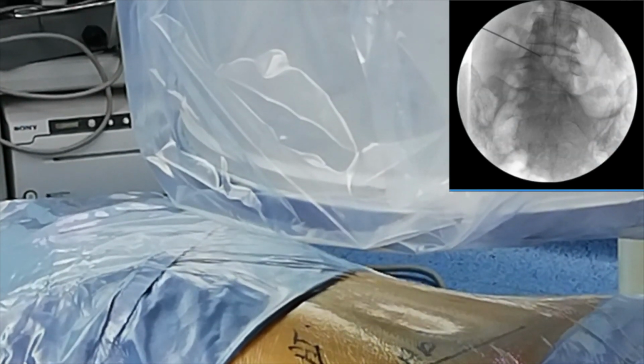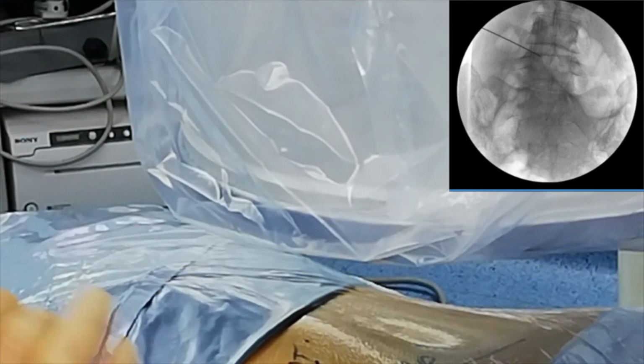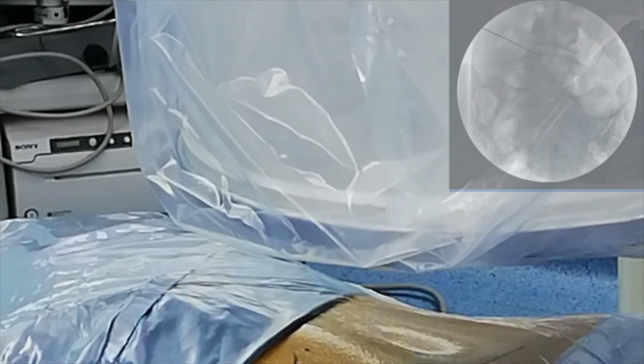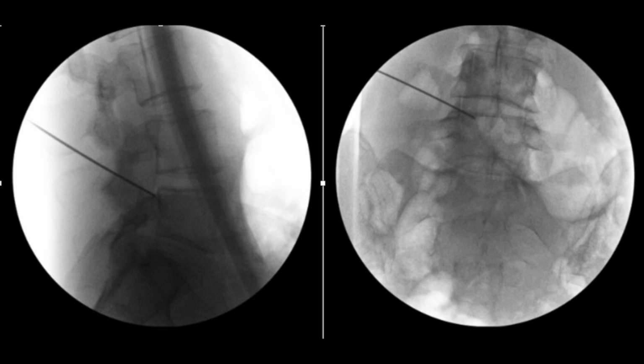Okay, and that's okay. I'm right at the medial border of the pedicle of L5, so this is perfect. I'm quite happy with that. Seeing the lateral and the AP views, on the lateral I'm in the posterior upper corner of L5, at the medial pedicle wall on the AP, and that's our landing point.